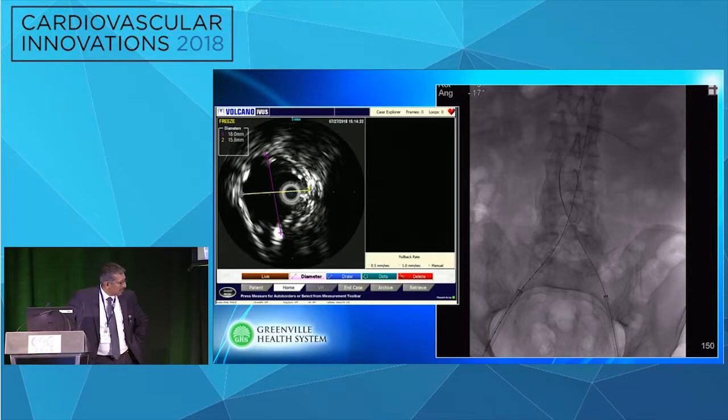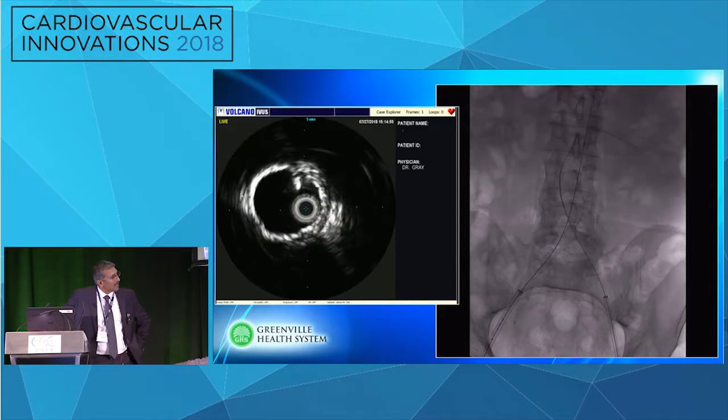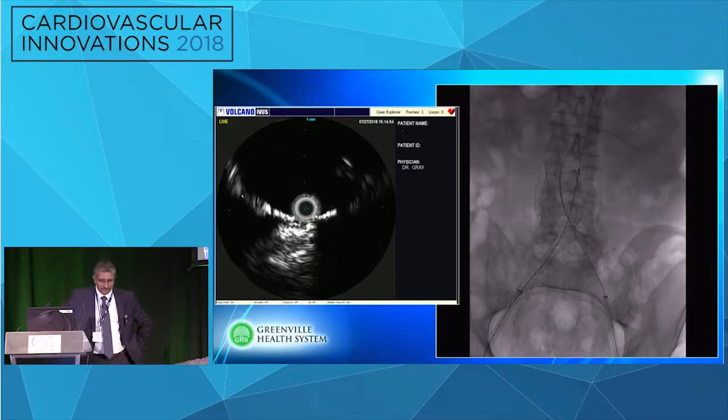So Tony, in your experience, IVUS and the CT measurements, are they pretty coincident? So that confirms what our preoperative imaging showed with our CT scan. That's good, thank you. So Peter, that was the next question. And so we'll just follow the, go live please, with the IVUS. Peter, can you talk about IVUS and CT correlations when he's done?